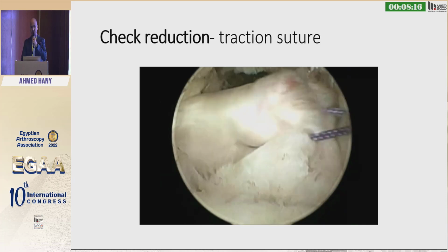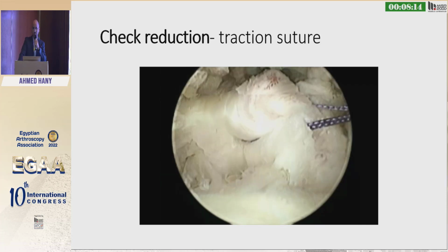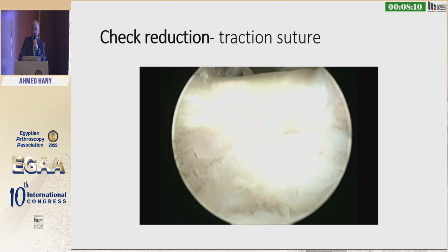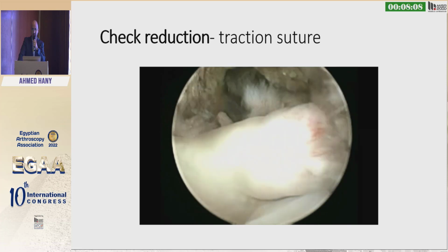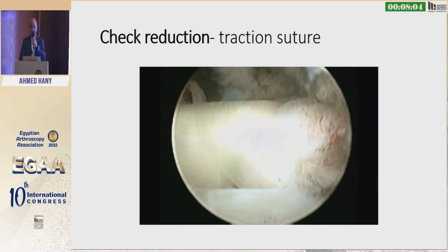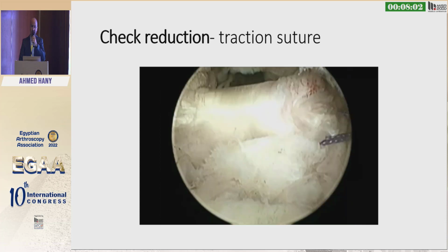And then I check the reduction. I usually put in a traction suture, make sure that I can get my subscap back to the bed easily. If I need to do more release, I will release more. But it's very important to take your time in the last few steps.